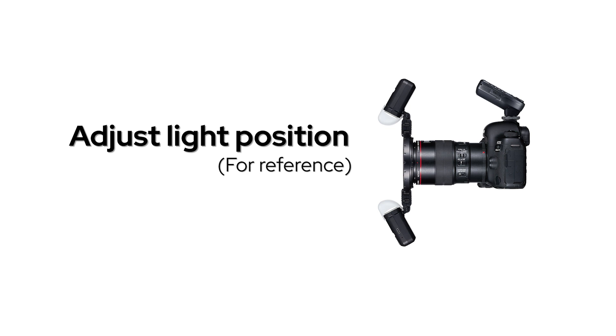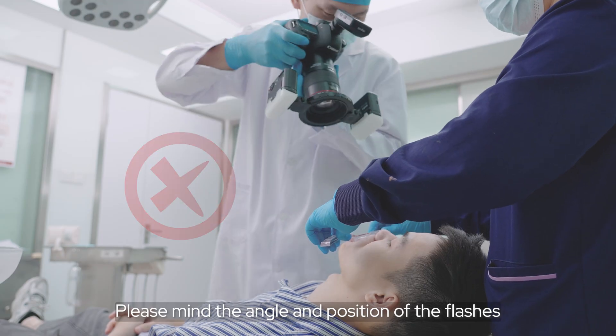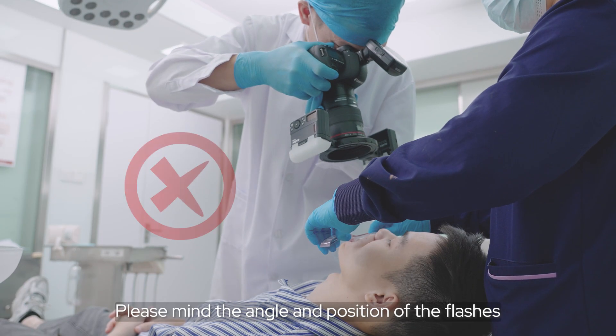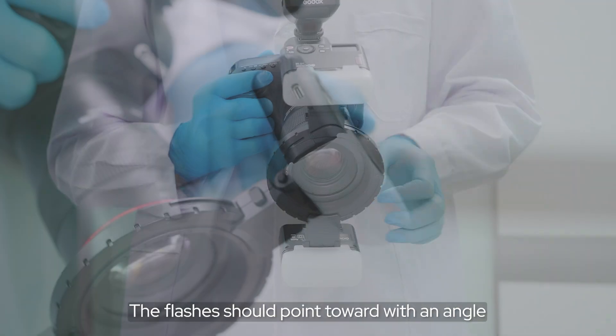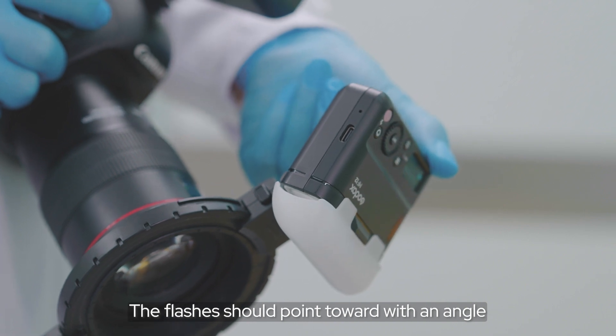Adjust the line position. Mind the angle and position of the flash, keeping it in the upper and lower position. The flash should point towards the mouth at an angle for better exposure.